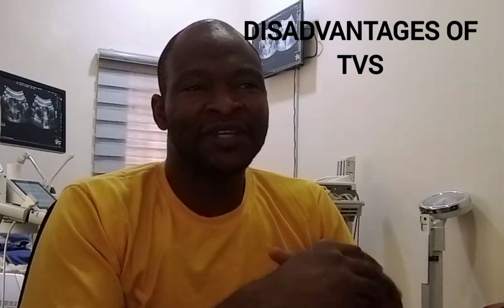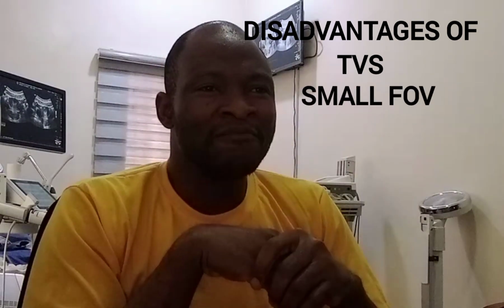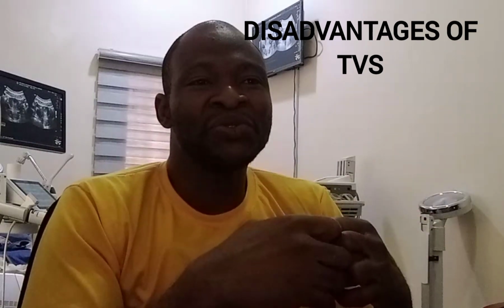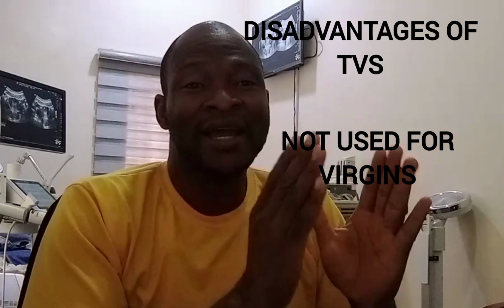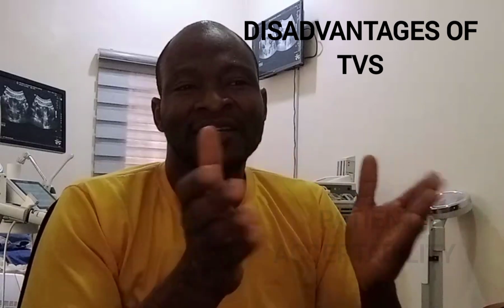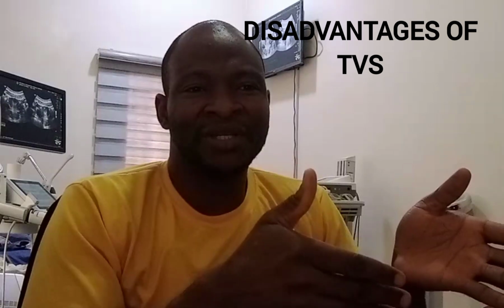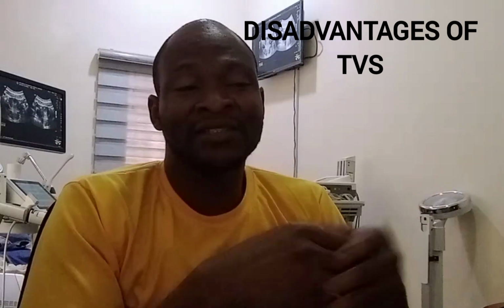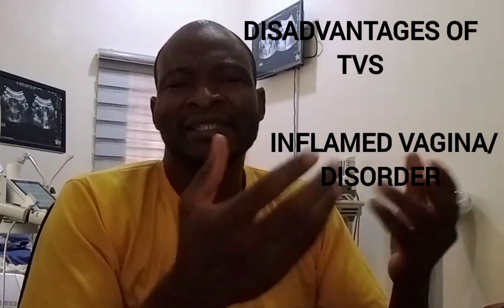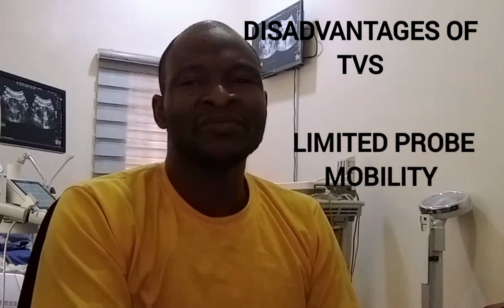The disadvantage of TVS is that it has a small field of view. Masses that are out of range of the probe are missed, and it cannot be used in patients with intact hymen. Again, we face the problem of patient acceptability, and some will not be comfortable with it. Some patients may not be able to tolerate a TV study, for example, patients with severe vaginitis or vaginal stenosis, and TVS has limited probe mobility.